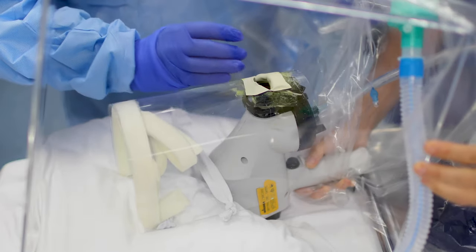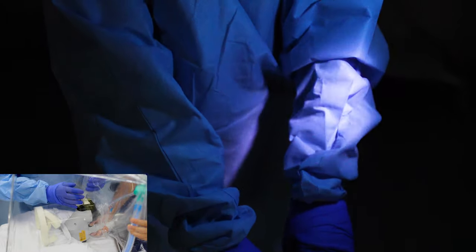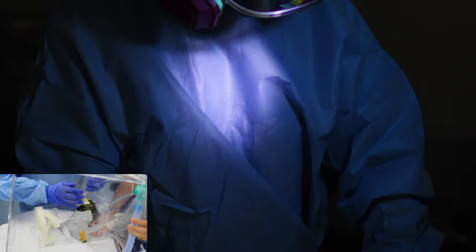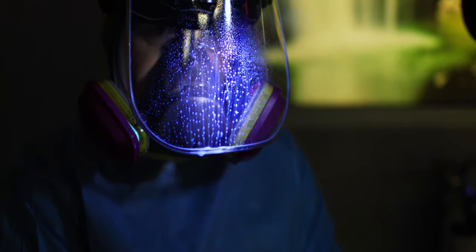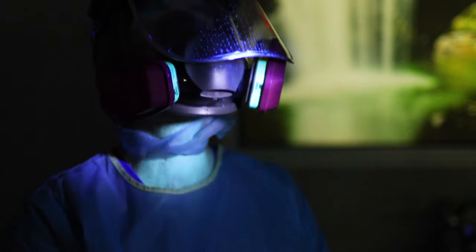I find it difficult to extubate with both hands outside the perspex box, so I attempted extubation with one hand outside the containment and one hand inside the box. Unsurprisingly, this led to some contamination of the hand inside the box. These final images are of my head after a half-second cough during unprotected laryngoscopy. This is a crude cough simulator and it tests droplets rather than aerosol.